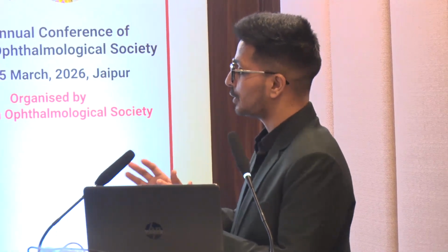Otherwise, every patient who was borderline in corneal thickness was subjected to the cross-linking procedure. What I'm not able to get is, one side we are saying borderline, other side you corrected minus 11 with some cylinder. That's impossible to correct with a borderline thickness. With a high corneal thickness, ma'am. Not all patients had it; the cutoff was that the RBT should not be less than 280 in any possible case. I'm a little skeptical, because 300 is what we usually keep, and 280 is what we used to follow in our institution.